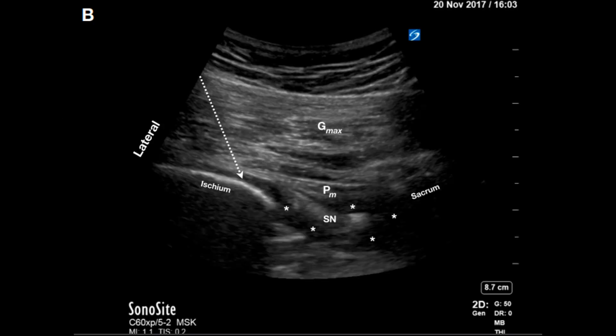An ultrasound image depicting the parasacral ischial plane block: an in-plane lateral to medial injection with bony contact at the posterior border of the ischium. An injection of 20 mL of local anesthetic spreads medially under the piriformis to surround the sacral plexus. The retroperitoneal contents can also be seen.